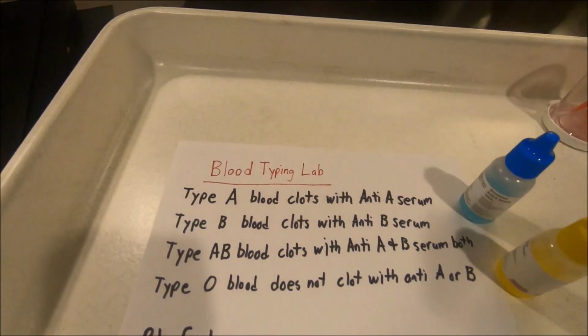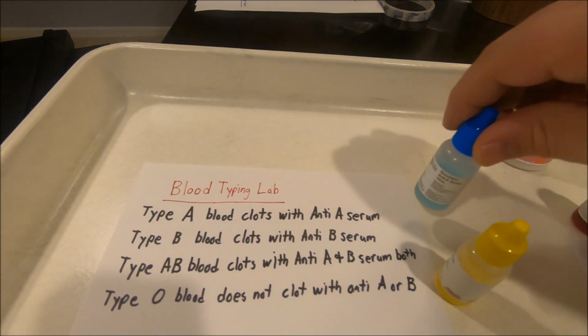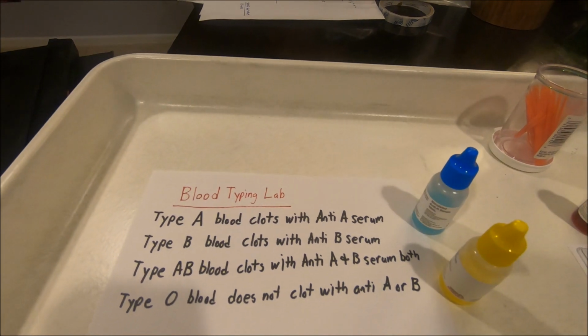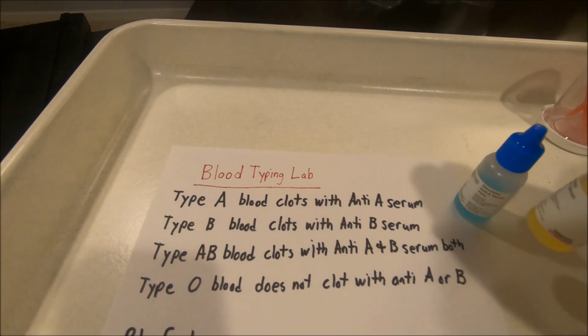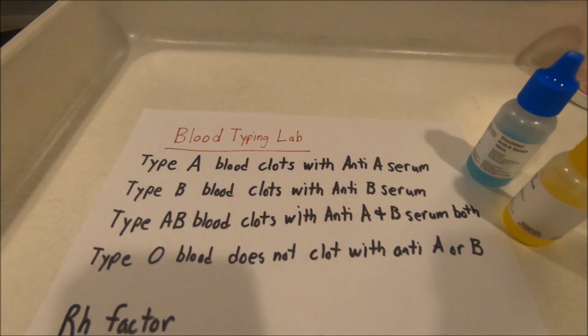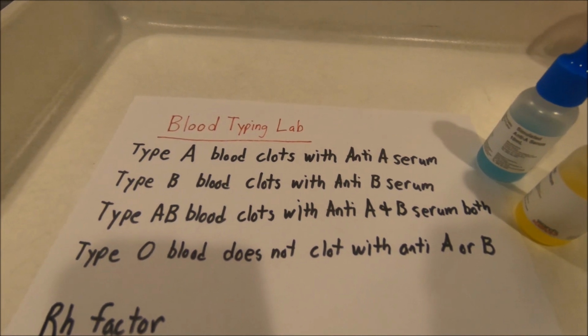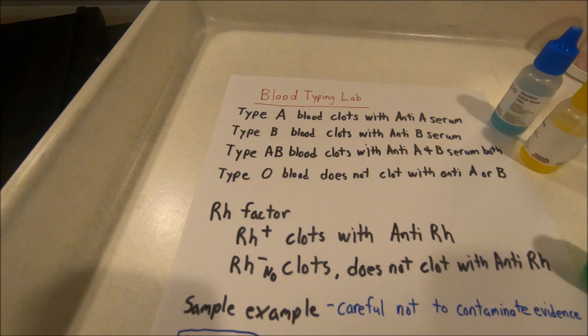Today in Forensic Science, we're going to be looking into blood typing. The idea is that when anti-A serum clots with the blood, you have type A blood. If it's mixed with anti-B serum and it clots, you have type B blood. If it clots with both, we have AB blood, or if it clots with neither, we have type O blood.